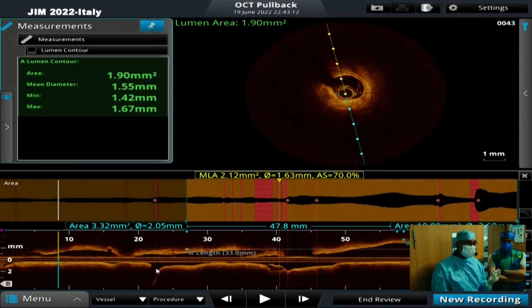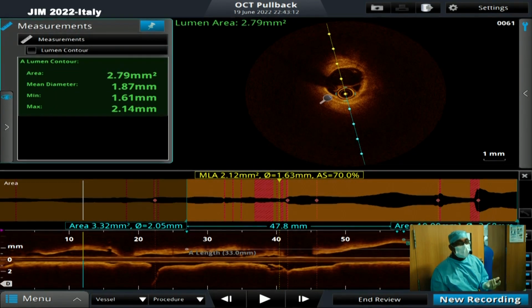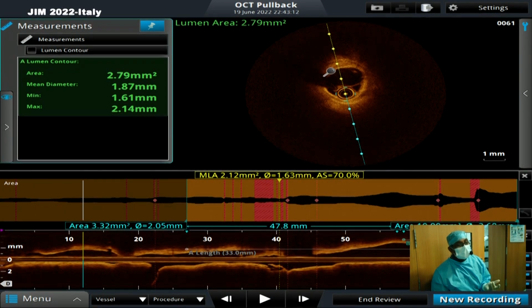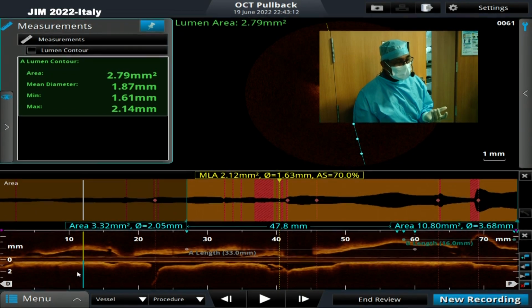That is what we had in our mind when we started off with the angiographic images. Well, you could see that the catheter is well inside the distal vessel. These are areas wherein you could see the 3 layers of the vessel. However, at 11 o'clock position, there is pathological intimal thickening, which was acceptable for us. The lumen area was 2.79 beyond the D2 branch.